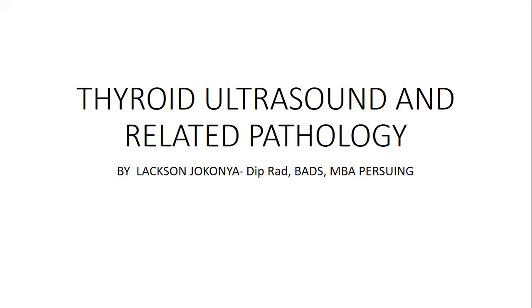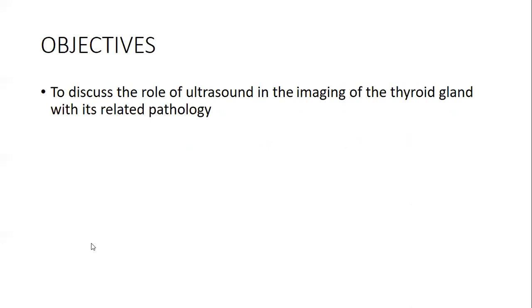Well, my name is Lackson Jokonya, a radiograph technologist practicing from Senanga General Hospital in Western Zambia. I just want us to interact around thyroid ultrasound and related pathology. The objective of this presentation is actually just one, not more than one: to discuss the role of ultrasound in the imaging of the thyroid gland with its related pathology.